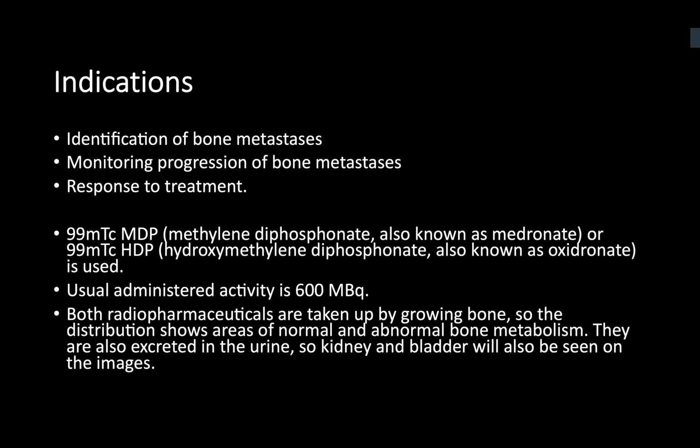What is the usual dose of MDP that is administered? I don't know. Sorry. That is one of the questions I had during the mock one. Okay. That's why I put it there. It was 600 megabecquerels. Okay.